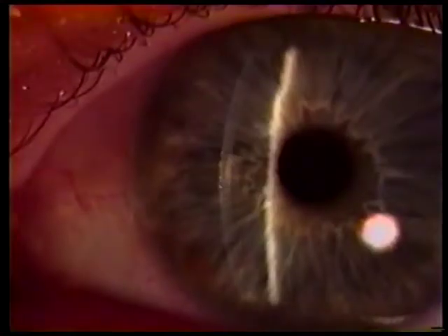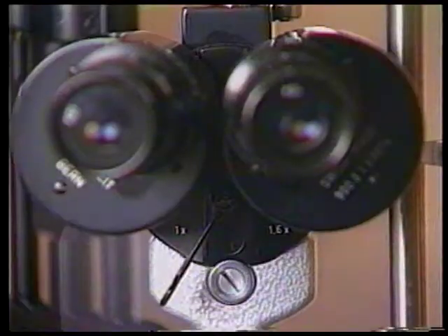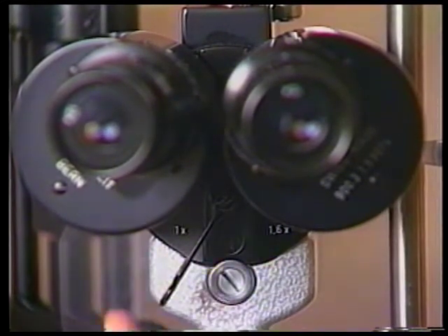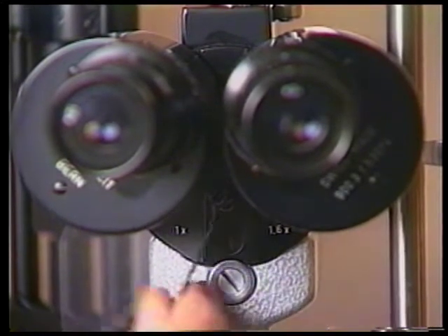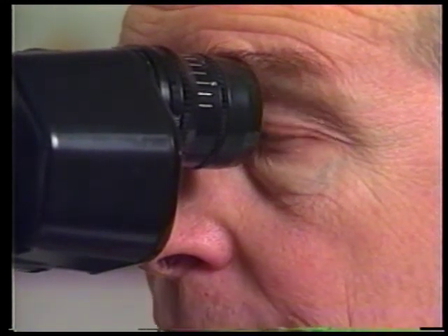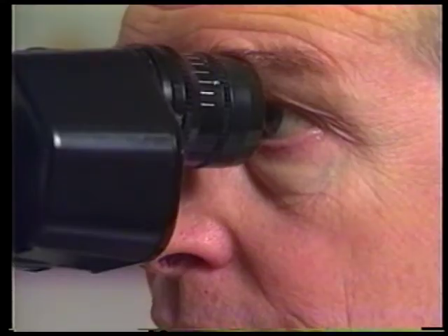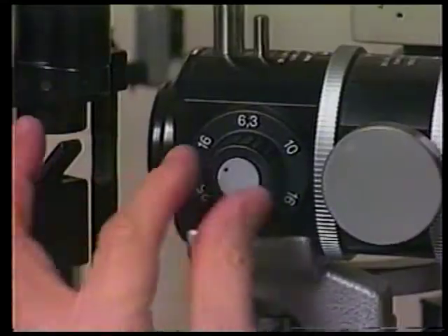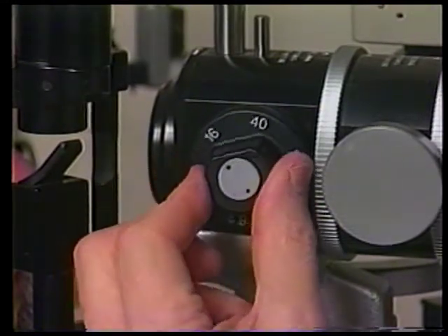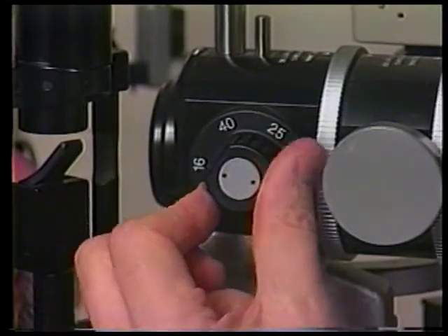The magnification can be increased two ways on the Haag-Streit slit lamp. The easier way is by moving the objective lever on the microscope from the left to the right, increasing the magnification from 10 to 16x. The second and more cumbersome method requires exchanging the 10 power eyepieces for the 16 power ones, thereby increasing the magnification from 16x to 25x. A newer model Haag-Streit has knobs on either side of the microscope body coupled to five variable optical elements that produce five different magnifications. Remember, higher magnification usually only makes what you don't know bigger.